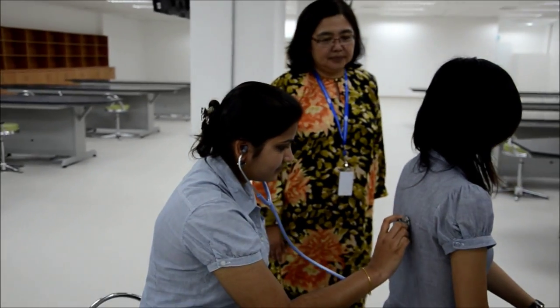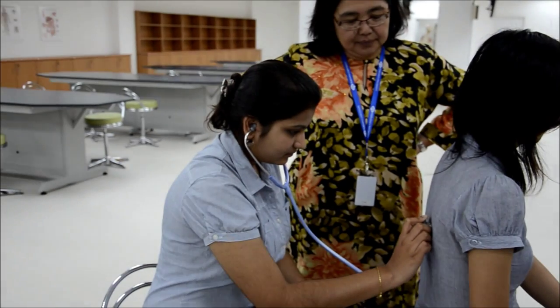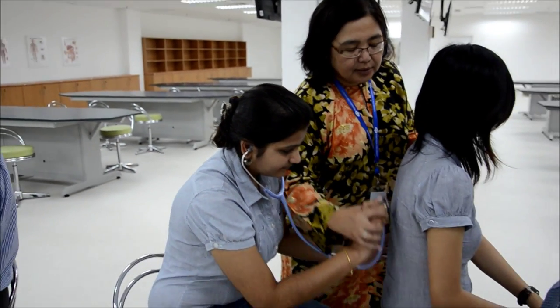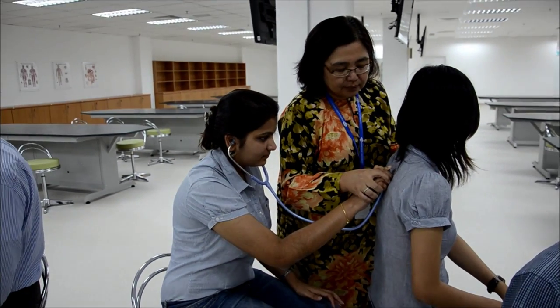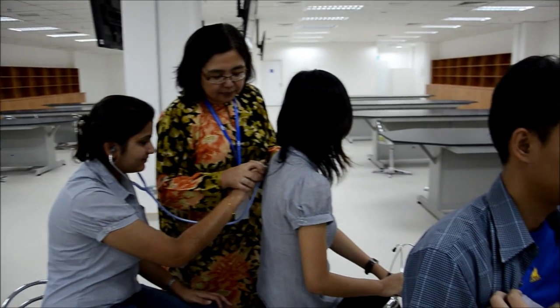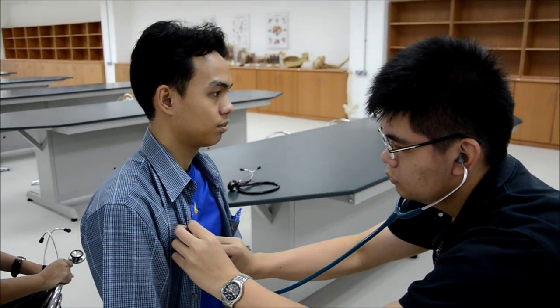Listen around to see where you hear better. Notice how it's different. If you listen over my pectoral muscle, it's going to sound a little bit more distant. If you listen down here, more directly on my ribs, it's going to sound louder. If it's a woman who has more breast tissue, you're not going to be able to hear anything through the breast. So you usually listen around the breasts, because you can't hear through them.